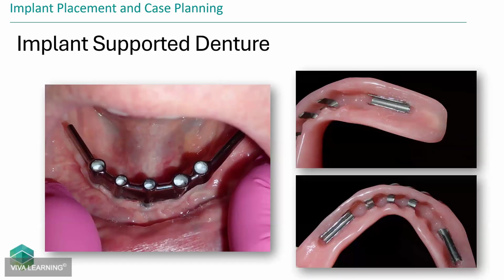So I think that's pretty clear. Implant supported dentures can be one of two options. And I think bar dentures are far underrated. I think bar dentures are fantastic. They are very, very strong. This is an example of a Dolder bar I did on a patient. We did this nice Dolder bar. This denture slips in and out, fully functional to a really high level.